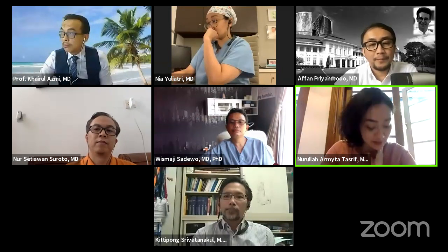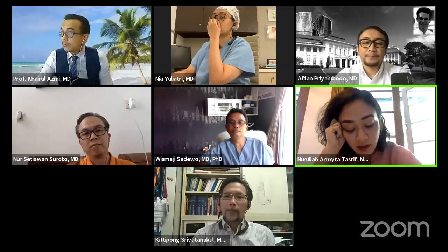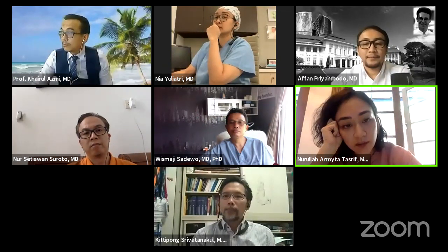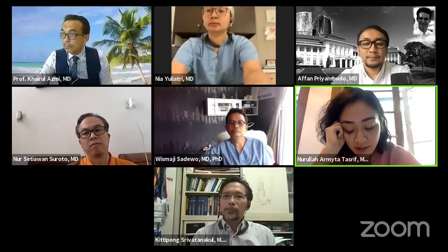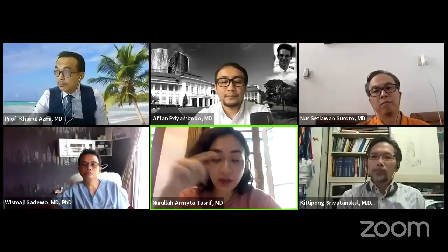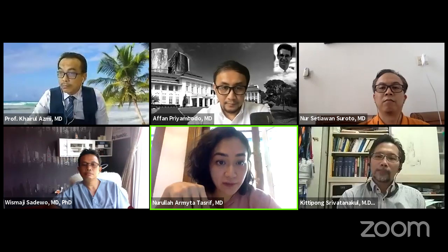First of all, thank you for a very informative presentation. In conclusion, you make selective angiograms, especially of the vessels that you mentioned above: the MMA, the falx for sure, the orbit for the vice versa flow from the orbit to MMA and MMA to the orbit, and also the posterior fossa.